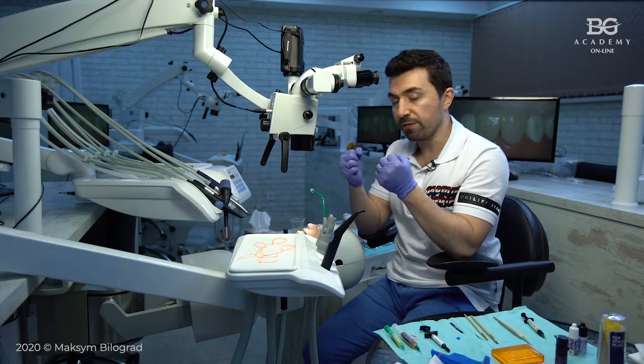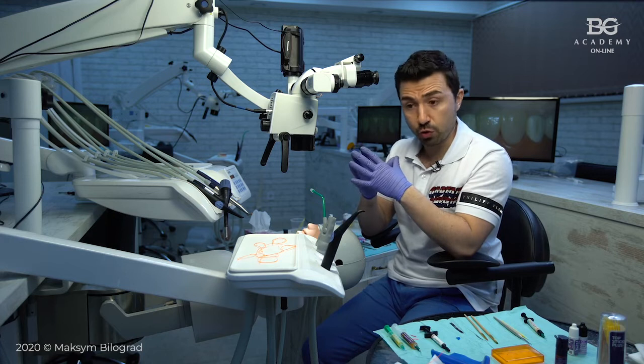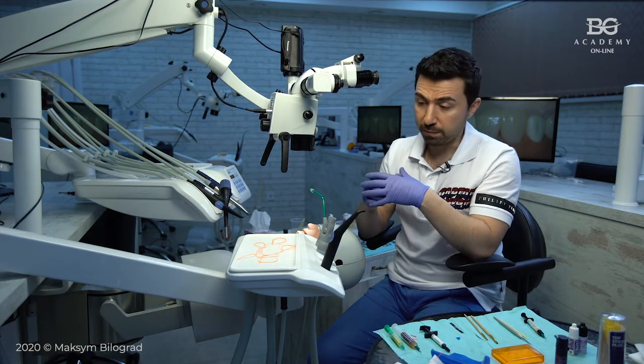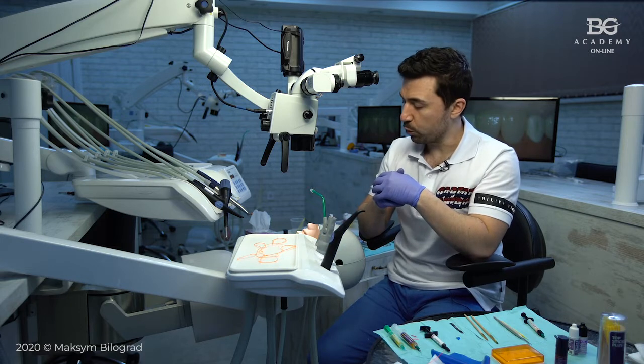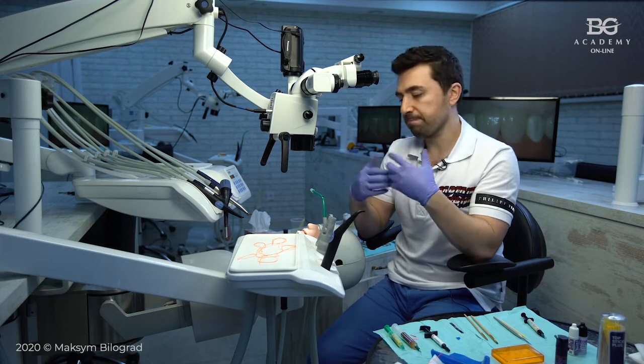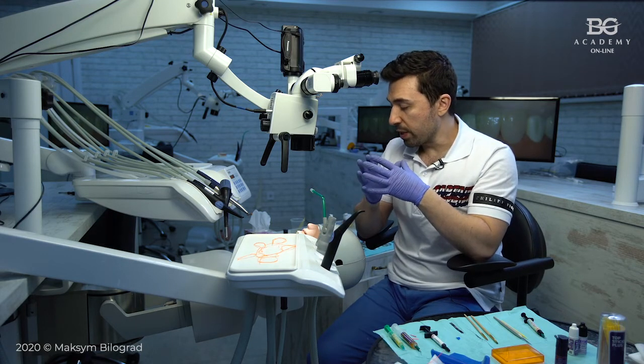In this case, if you have this show-out effect and the surface fit of your veneer is good, don't try to mask this with opaque cement, because that will not help you. That will be a problem then to remove these veneers. So if you have this effect, the only thing is to redo them, okay? To redo them with a dental technician.